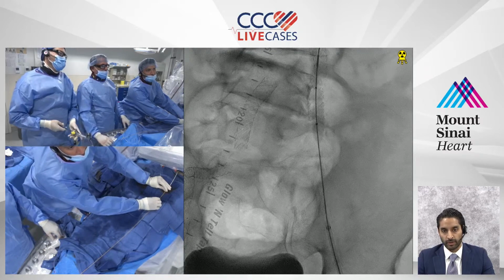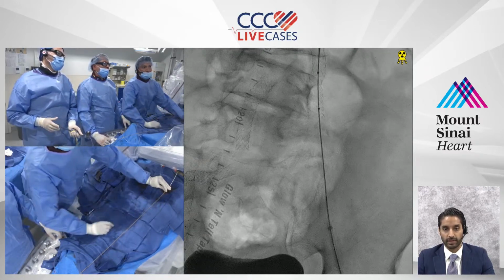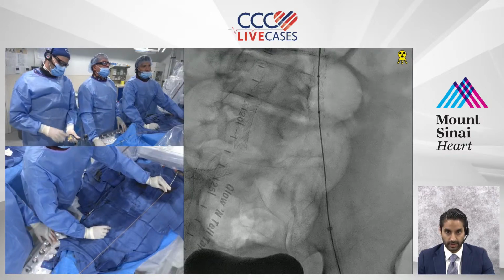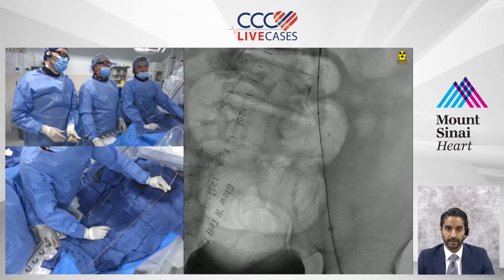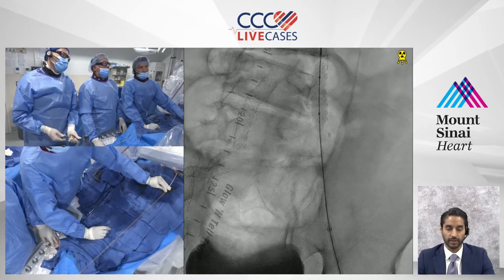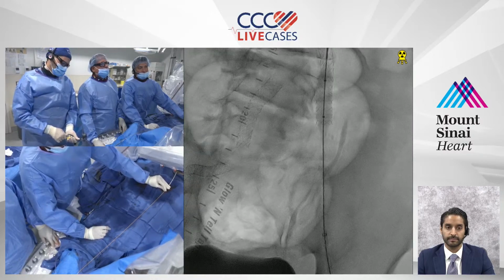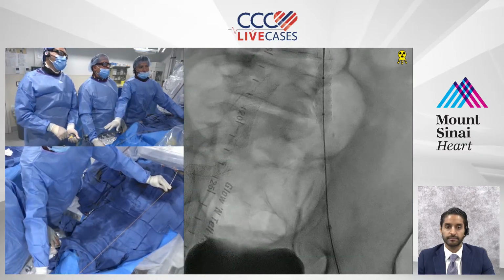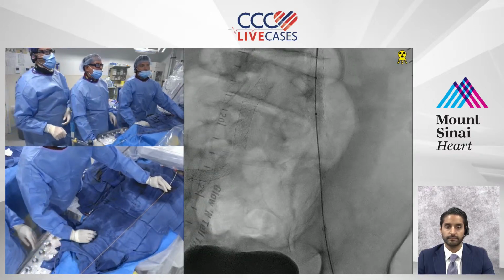So you can hang it out. Avoid possibly having a very large mismatch, because as we pointed out earlier in the case, there was definitely an aneurysmal segment in that external, which is right. And I think the advantage of this VBX, go to, what is nominal again? 8. No, he's feeling it. He's feeling it. Leave it at 8. Okay, down. Okay.